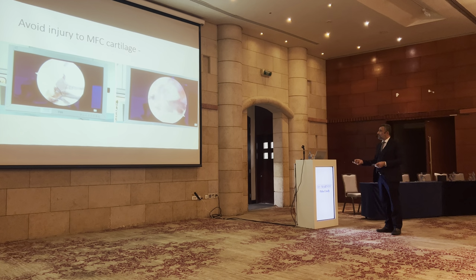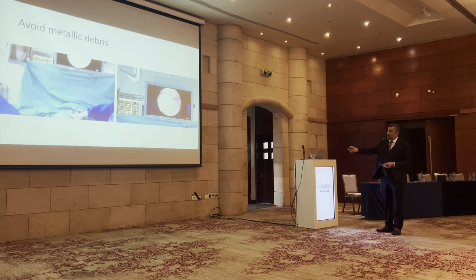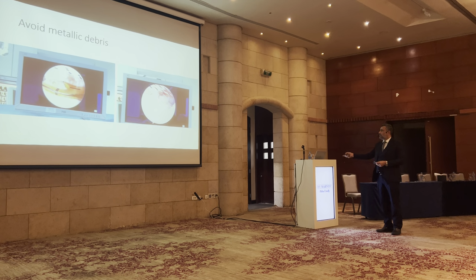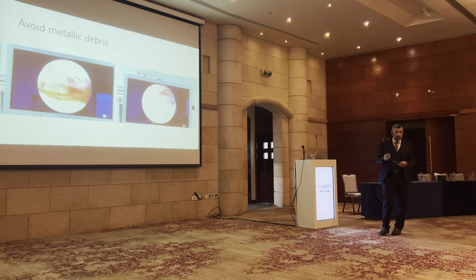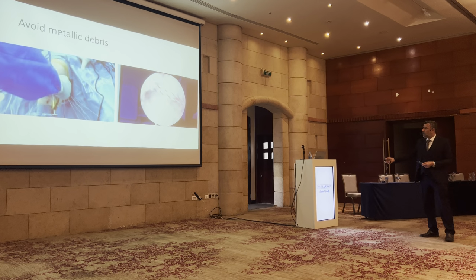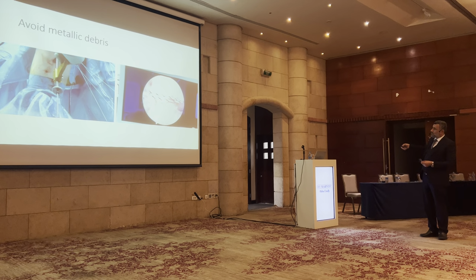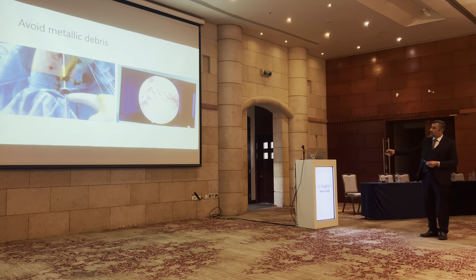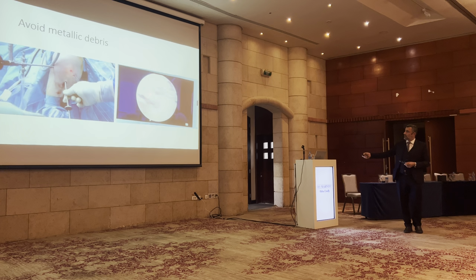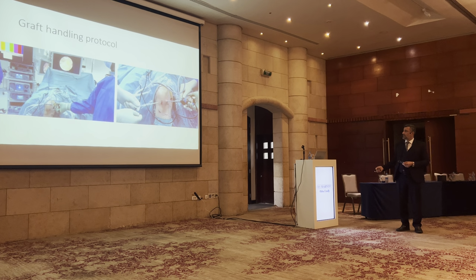Okay, now the same for removal. Now this is, I think we discussed that, how to prevent metallic debris. We stop before and then do drilling. And after drilling, before we leave the tunnel, we check how anatomic we are. So when we get inside, we do range of motion to see the relation between the reamer or the flip cutter and the notch, like here. Okay. You see? So it's anatomic, we proceed.